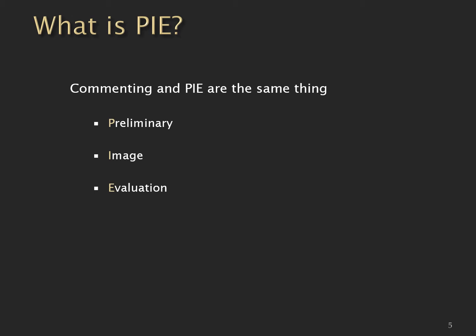Now, this could be recorded as, for example, a PACS note that would be seen by the referrer and will provide a timely alert to the referrer and a short description of an acute pathological finding.